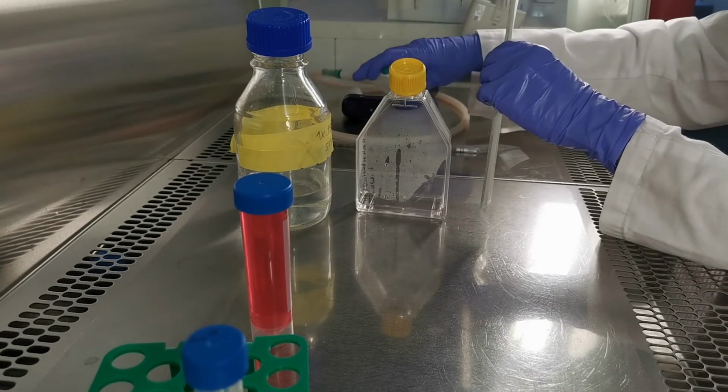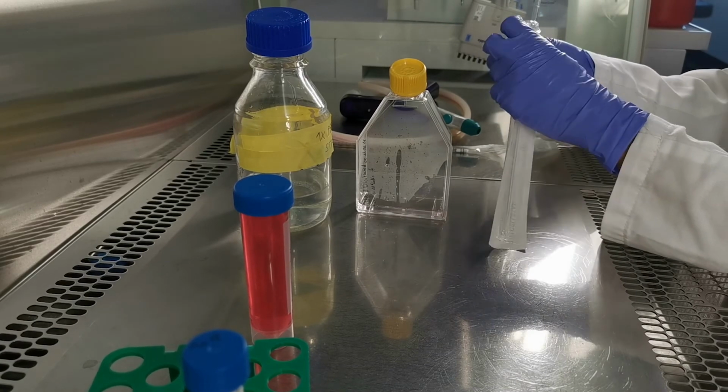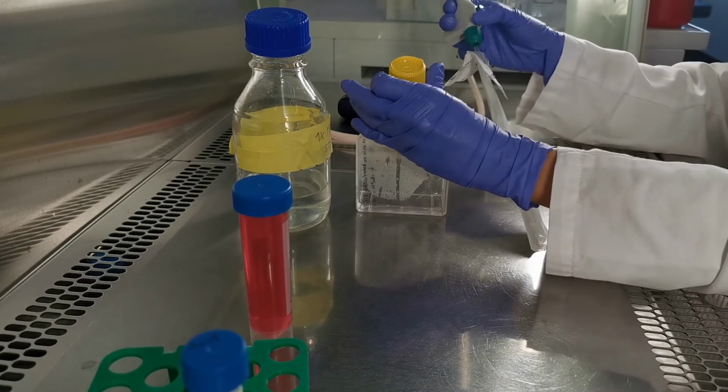Following this, the PBS will be aspirated and we will add 2 milliliters of trypsin to the flask.